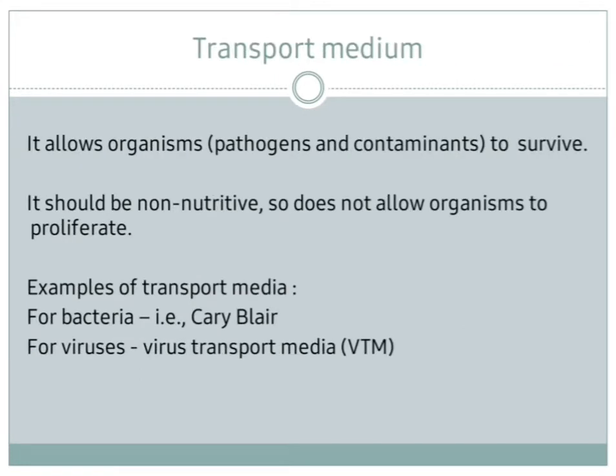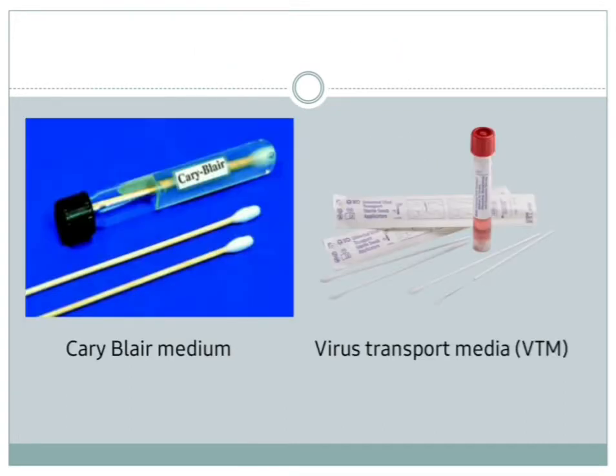The transport medium, they are a specific medium that allows the organisms, the pathogens and contaminants to survive. And this medium should be non-nutritive. Otherwise, the organisms will proliferate and this will give a false result. So it should be non-nutritive in order to have the same amount of the pathogens that is initially present in the patient.